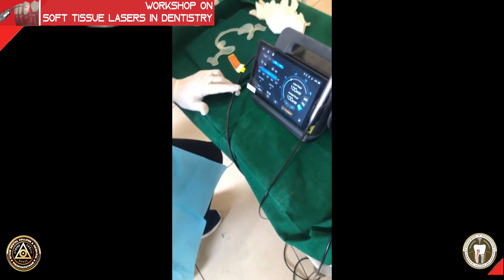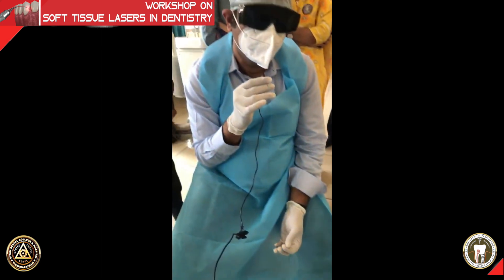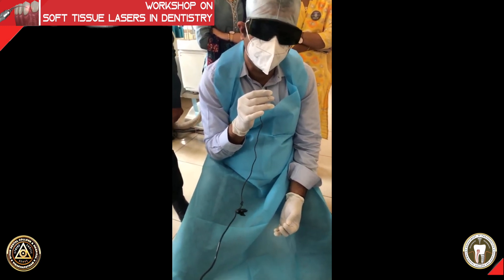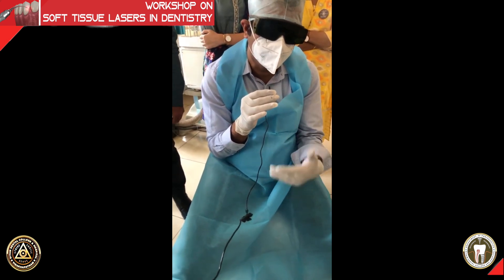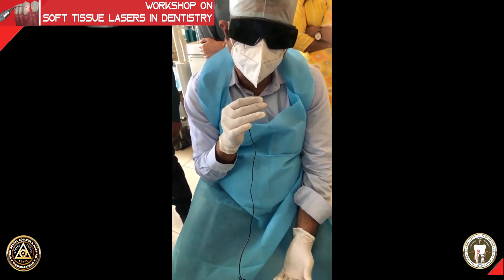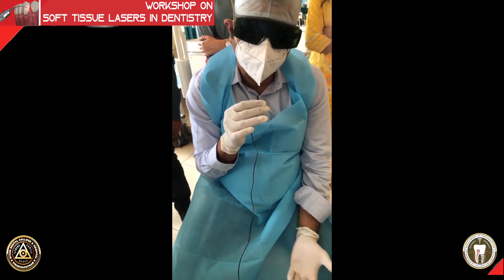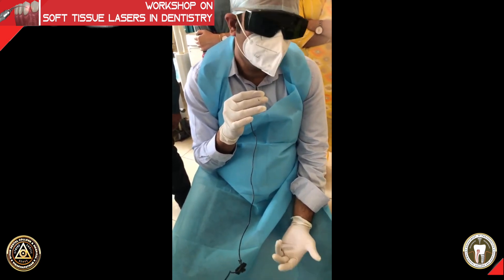The steps in the procedure: first we take the dye and inject it subgingivally. Once injected subgingivally, there is a binding time of one minute. The binding time is the time taken by the dye to bind to the subgingival bacteria present in the periodontal pocket area. Once that one minute binding time is over, you flush out the excess dye using normal saline, irrigating subgingivally to remove all excess dye from the pocket area. Only after the dye has been completely flushed out do you introduce the laser.